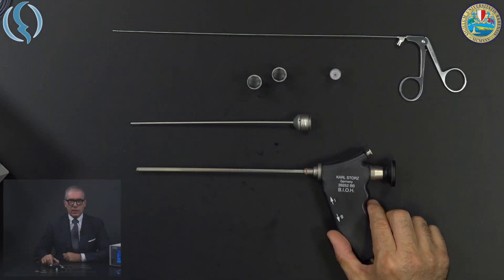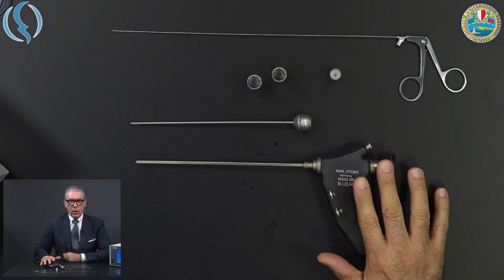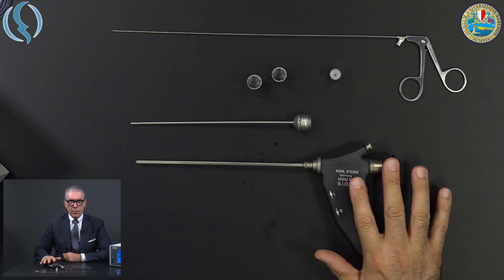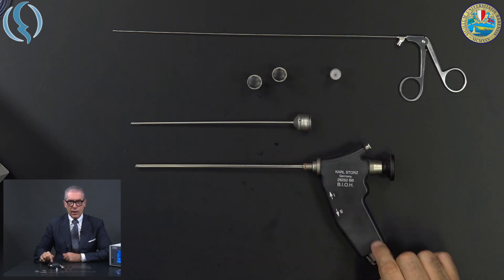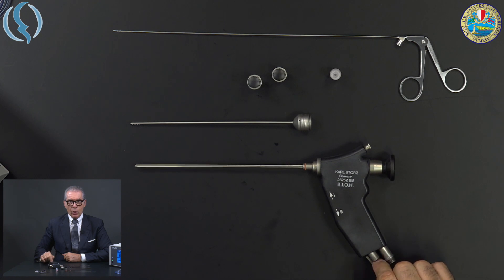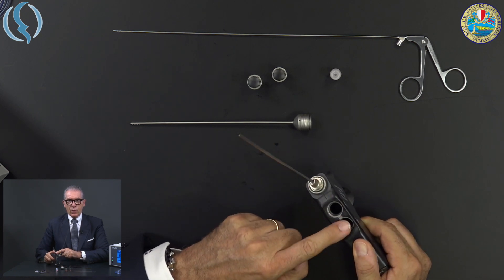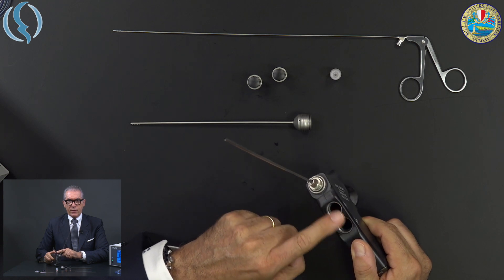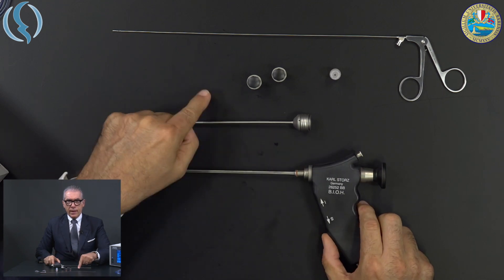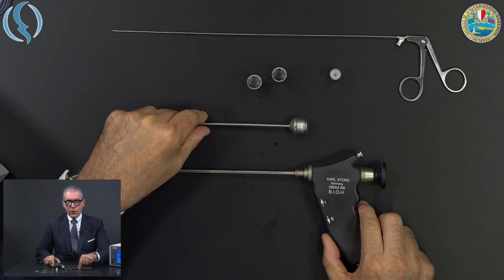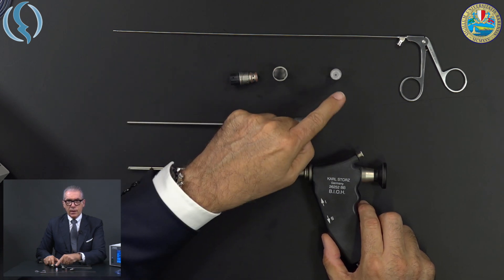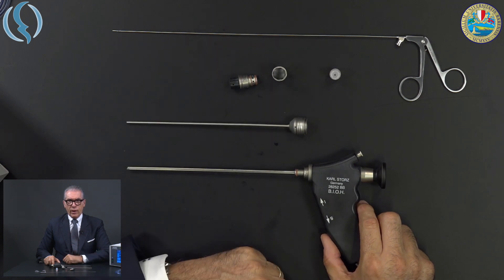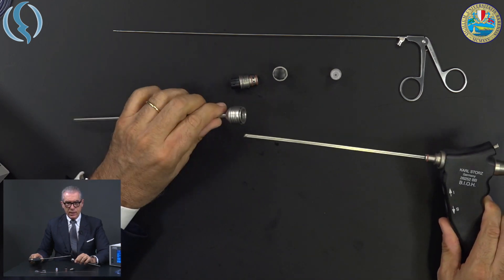This is our scope totally disassembled. You see this is the main body with the handle that includes the optics, the instrument channel that is also the inflow channel, the light cable and the monoblock connector plus the two holes where you will insert the valves. Then the outer sheath, the two valves, the stopcock and one of our instruments. So it's very easy to assemble.